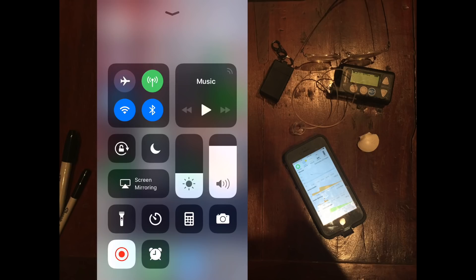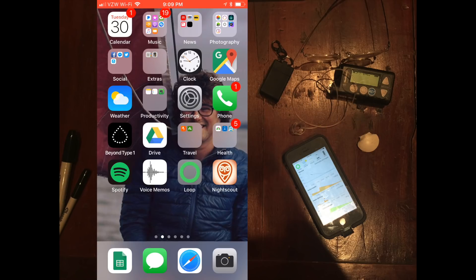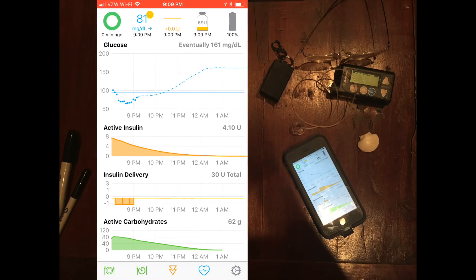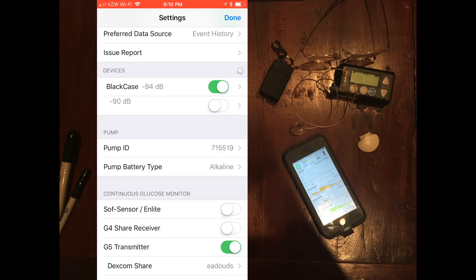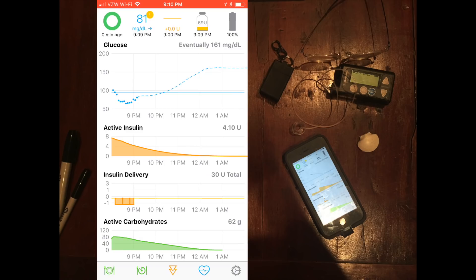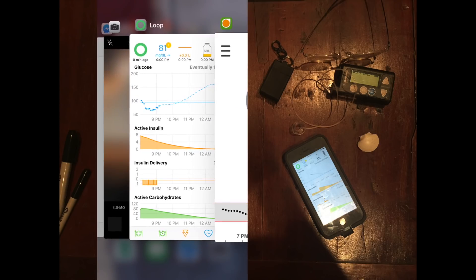I'm going to walk you through the looping app. It's pretty simple and straightforward. I'll launch it right here — loop on the home screen. Starting in the upper left-hand corner, that complete green circle shows that I'm in closed loop right now. You can actually run this in open loop, which means you're able to bolus from your phone but it won't automatically make all the decisions for you. That 81 is pulling in from the Dexcom app.